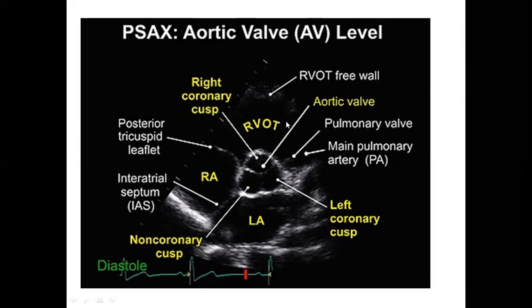Whether or not we have stenosis and pathological turbulent movement of the blood jet, or maybe we have some regurgitation from ventricle to the atrium if we have tricuspid insufficiency, or from pulmonary artery into the right ventricle. That is also an option. So we can see actually very, very different things.